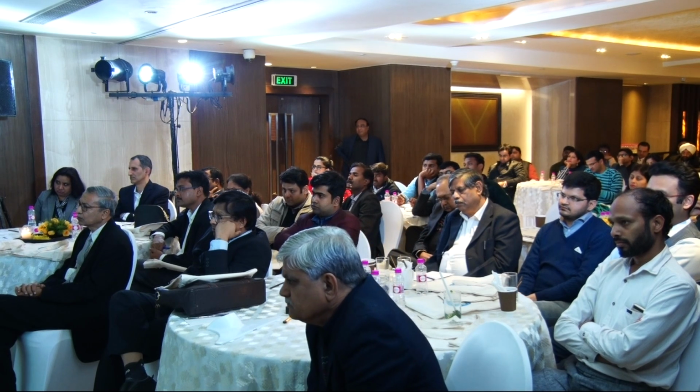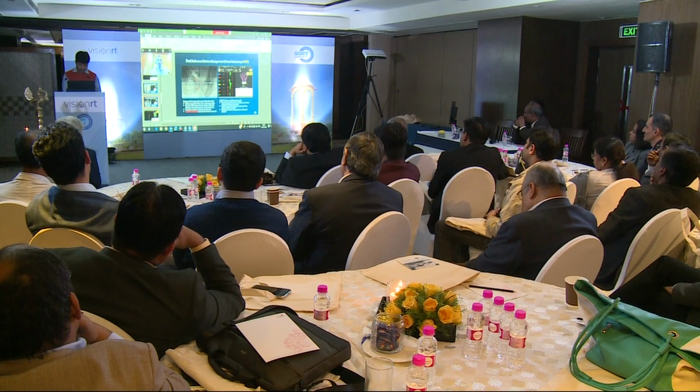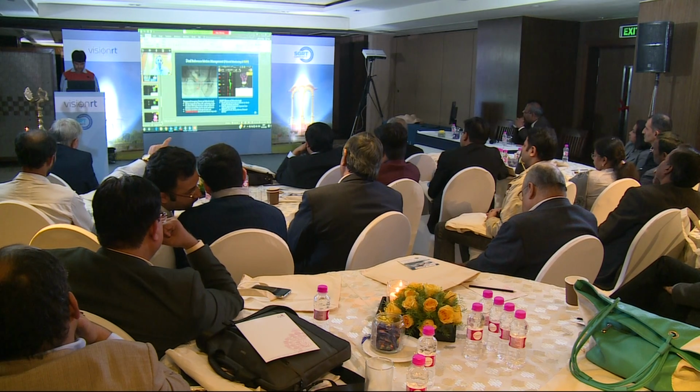Where this really, really excels, we find in our institution, is for prostate SBRT. We don't see a lot of lung tumors move unexpectedly during treatment, but on a prostate, if you have gas in the rectum or gas passing through the rectum, we do the same process. We'll basically set the patient up to their external anatomy on slide 23. We do a cone beam CT, we take a gated capture, we set our 2 millimeter tolerances, but then on the triggered image, we've also contoured 2 millimeter spheres around each of the fiducials. So we have gold implanted fiducials. Our tolerance is 2 millimeters, so we put a 2 millimeter sphere around each fiducial.